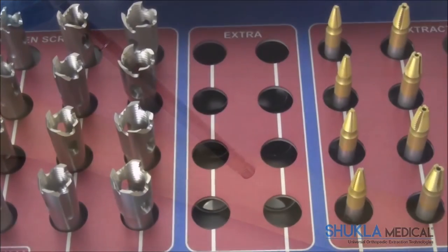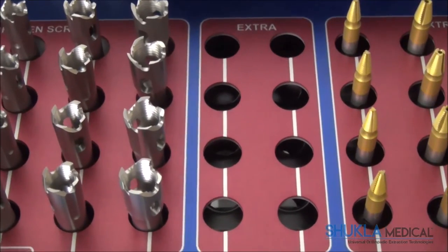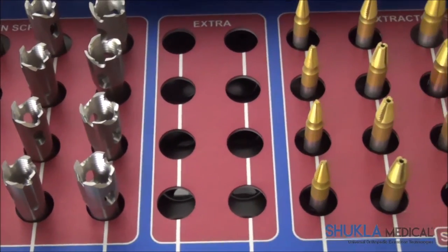There are two empty rows marked extra to the right of the broken screw extractors for additional extractors, if needed.